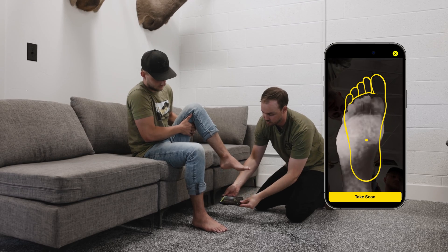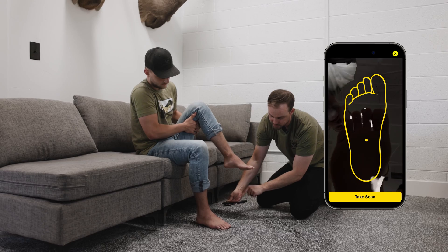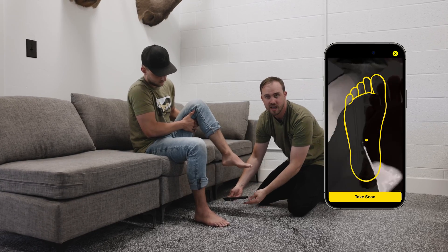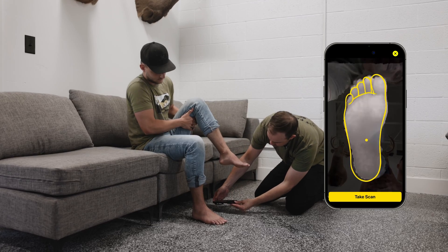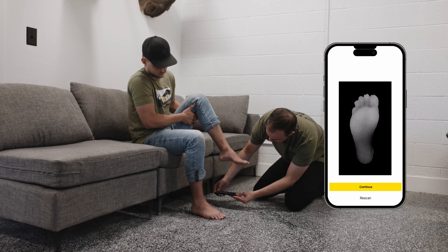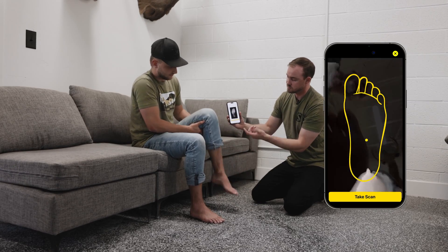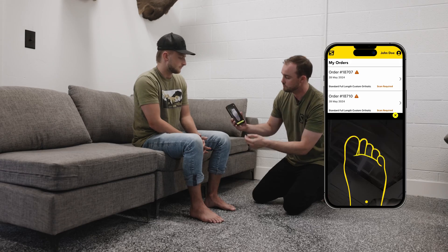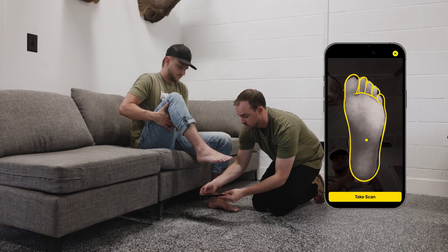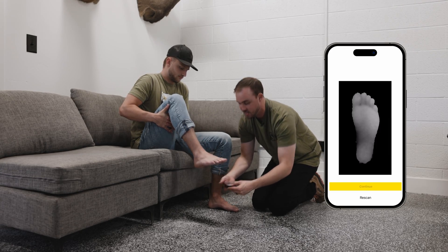We don't want the phone angled out — keep it as parallel as possible. Hover so the big toe and the heel are kept as close as you can within the foot shape outline. Put the foot in the frame, match up the heel and the big toe, and take the image — it's as simple as that. Then press continue and do it for the other foot, keeping it parallel with heel and big toe aligned.